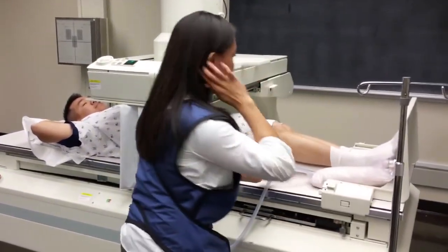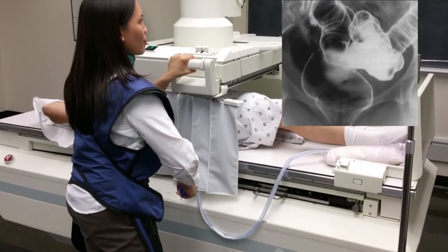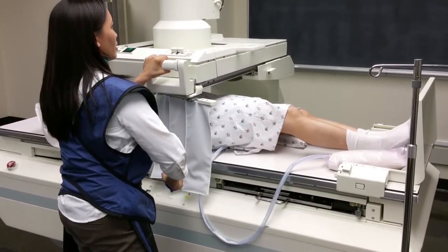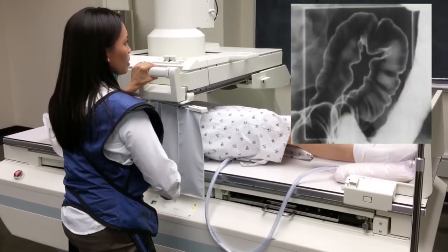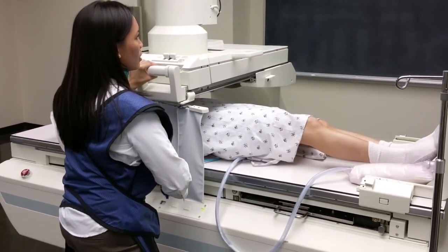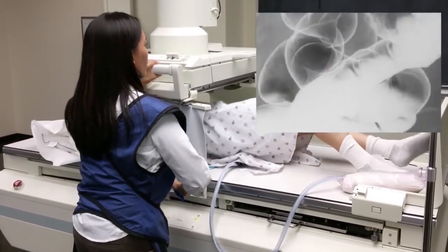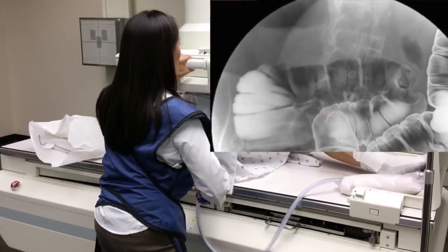The bag is then clamped, and I tell the patient I'll put some air in the colon to complete this portion of the exam. The air is pumped from either room air, or some departments use carbon dioxide. Make sure that you do this slowly, otherwise the patient experiences severe discomfort and it might incite rectosigmoid spasm. I like to instill 2 to 3 puffs with intermittent fluoroscopic pulses, position the patient, then again instill 2 to 3 puffs. And I keep doing so until the colon is properly coated and distended.